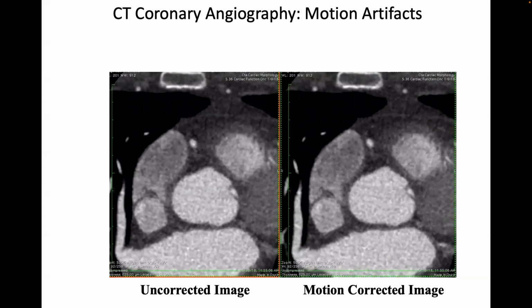It essentially takes reconstructed images at 3 time points, and it looks at what changed between the middle time point and the one forward in time, and the middle time point and the one backward in time. It uses that to estimate a motion field and then make the corrections, right? And then remap pixels, right?